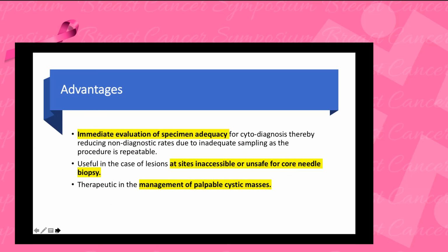Now, its advantages are that it's a quick test, it's cost effective, like we said, no need for local anesthesia, and if we do rapid on-site assessment, we are able to actually reduce the non-diagnostic rate.